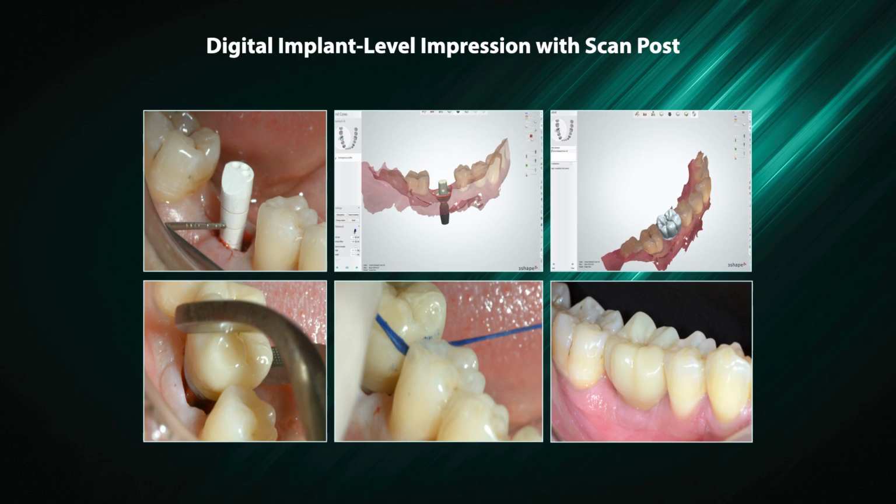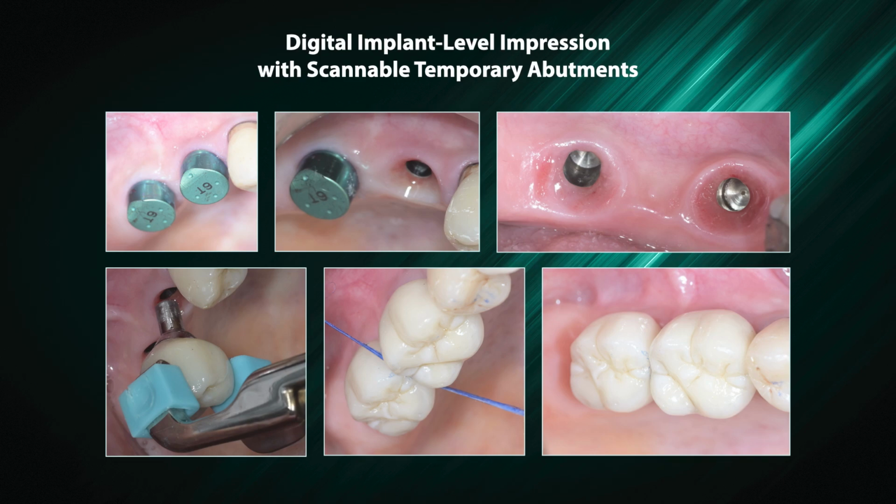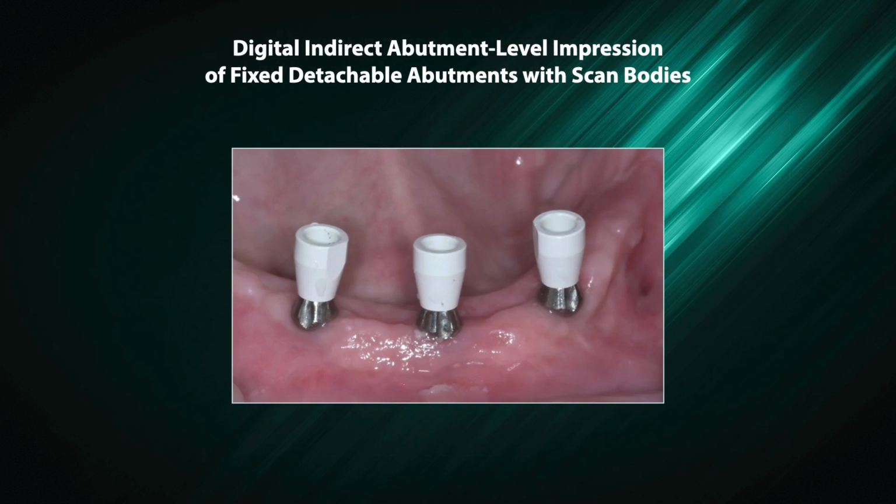Digital implant level impression with scan post. Digital implant level impression with scannable temporary abutments. Digital indirect abutment level impression of fixed detachable abutments with scan bodies.